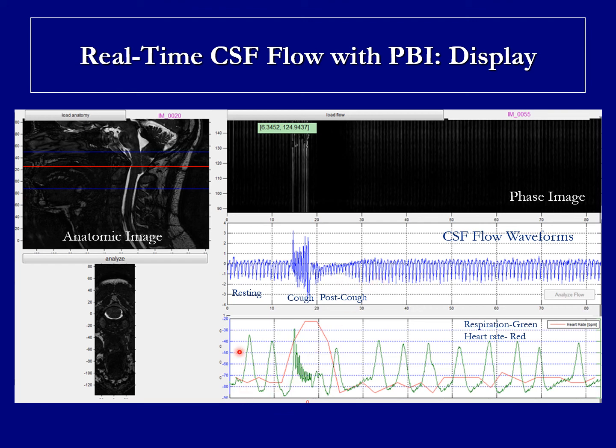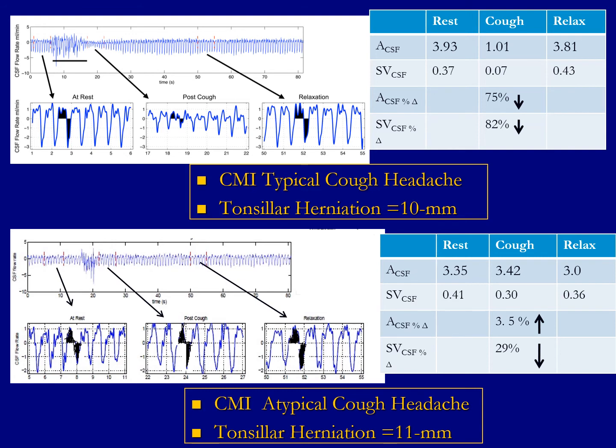In the bottom part, you can see the waveform of the respiration. Here, the patient is quietly breathing and then suddenly coughs here. That is the movement related to the cough. And again, the patient is breathing quietly. The heart rate changes are also seen. Suddenly the heart rate goes up and then comes back. While coughing, and immediately after coughing, the heart rate also goes up.